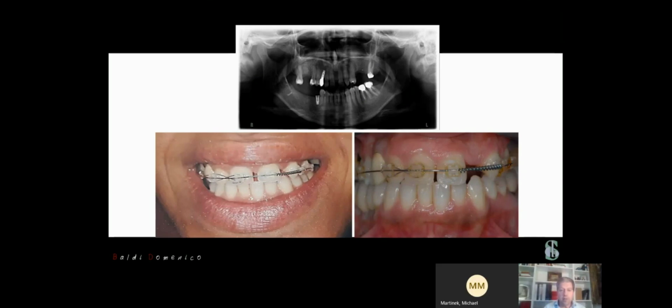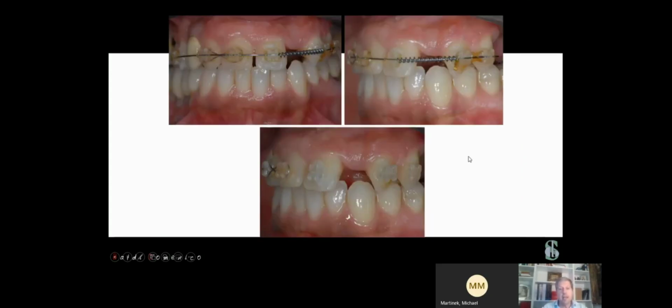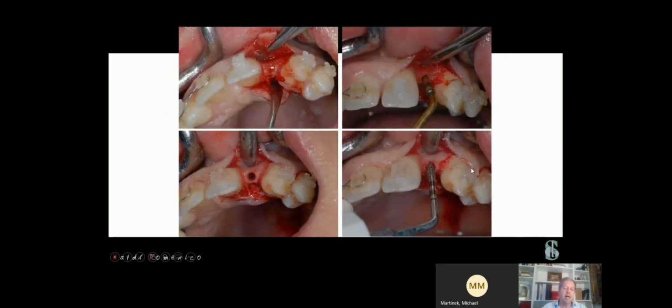In the anterior part, it was necessary to do ortho in order to move the central tooth, in order to create this space to place the lateral tooth, because here we had an agenesia of the lateral tooth. So we did ortho treatment in order to create the space, and now it was possible to prepare our implant site. But unfortunately, we have enough space from the crown point of view, but not so much space from the root point of view.